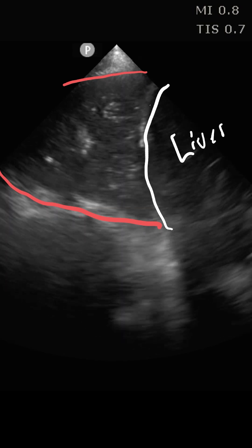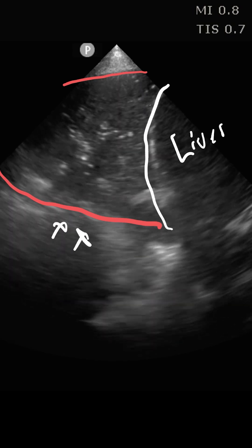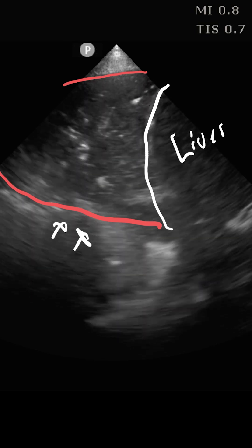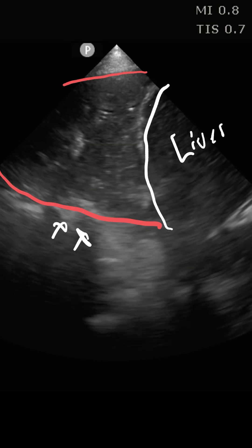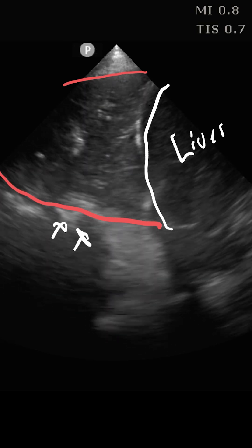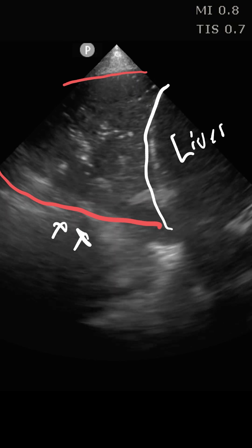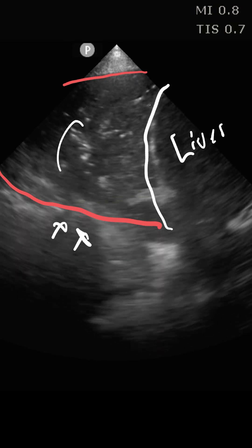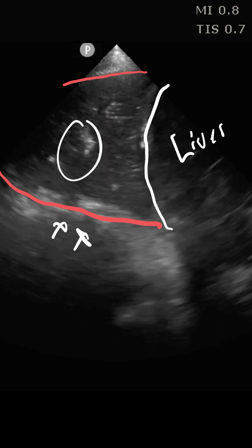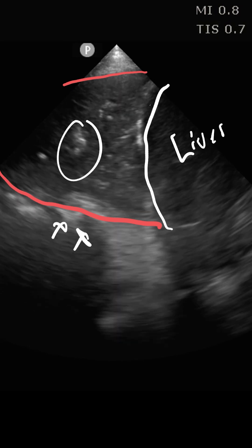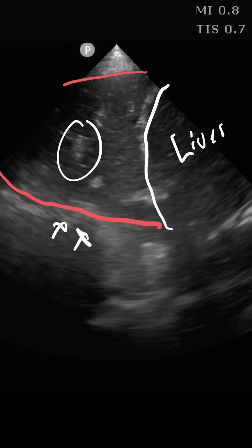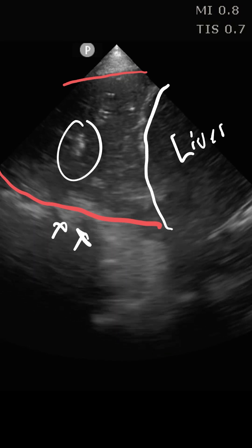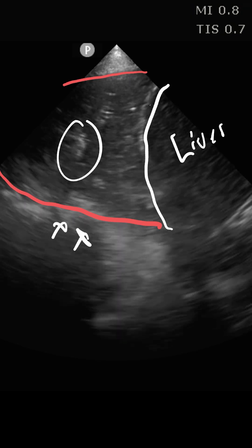Number two, we see the spine sign back here, which represents sound transmission rather than sound reflection from an air-filled lung. And finally, number three, we see these bright white speckles throughout the lung tissue — this is called air bronchogram, which is air in the small bronchioles that persists even though there's alveolar filling or consolidation.